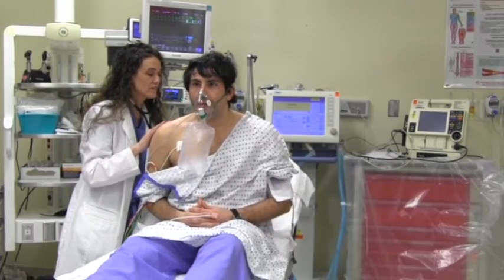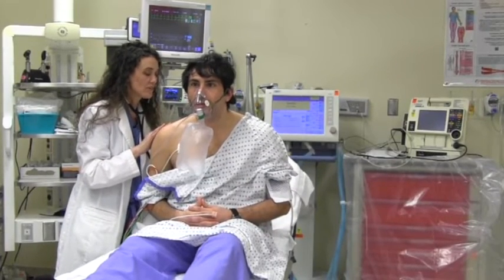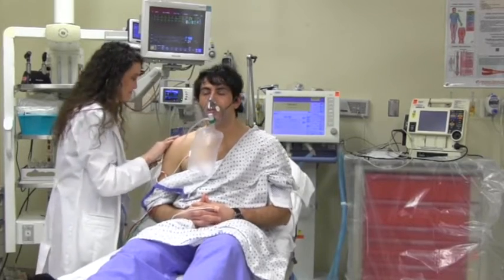Deep breath in and out. Once more, and then lay back.